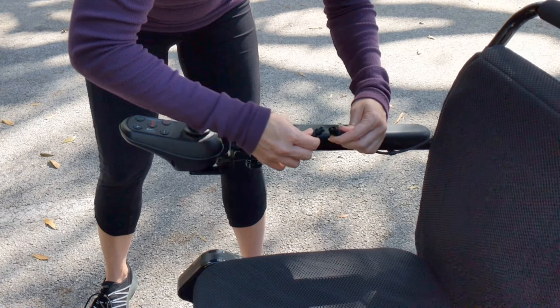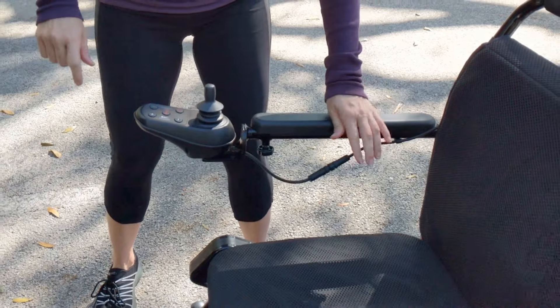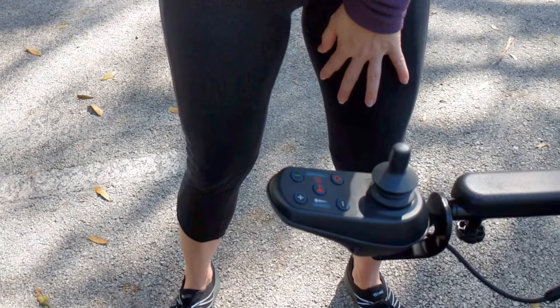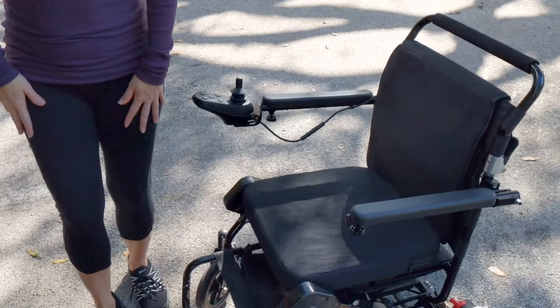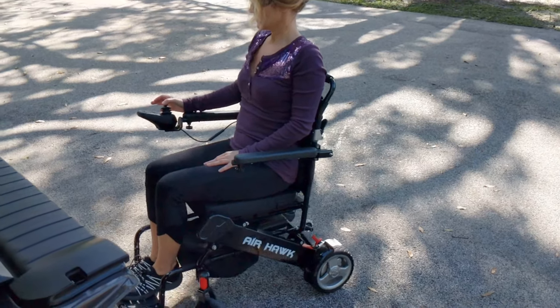Very simple to do — you just align a very basic key, slide the safety mechanism into place, and there we go, we're on and we're ready to go for a ride. Very easy to get into the Airhawk.